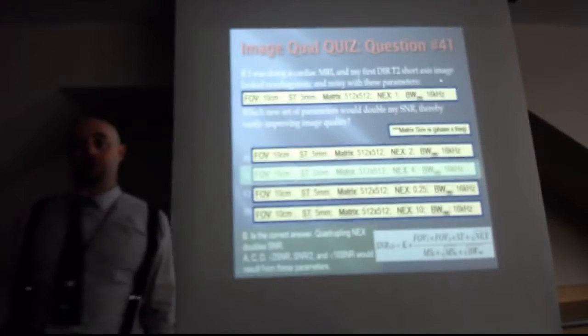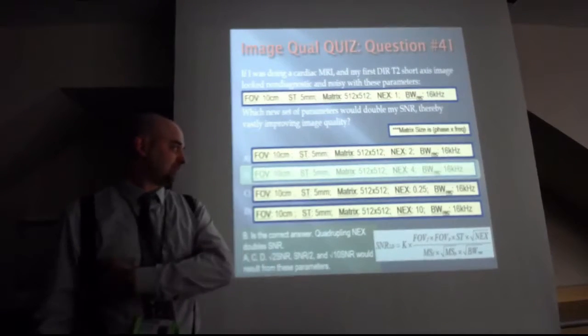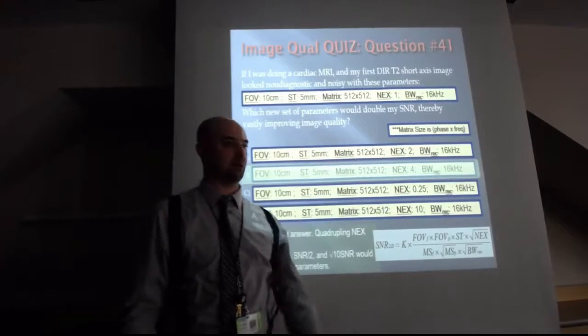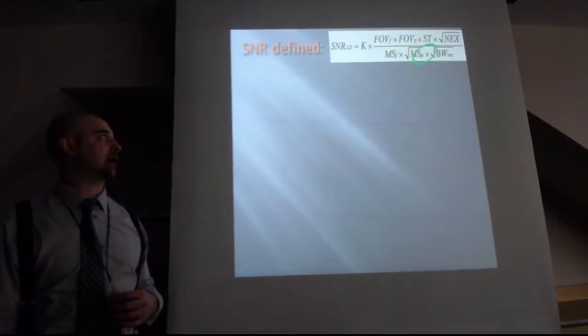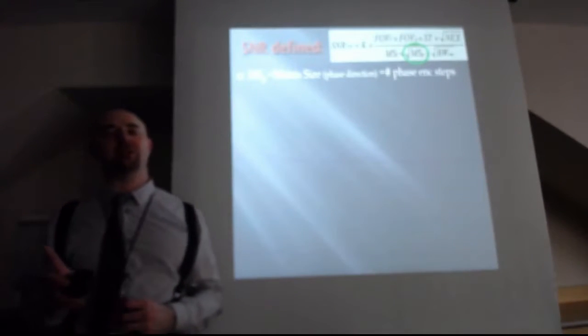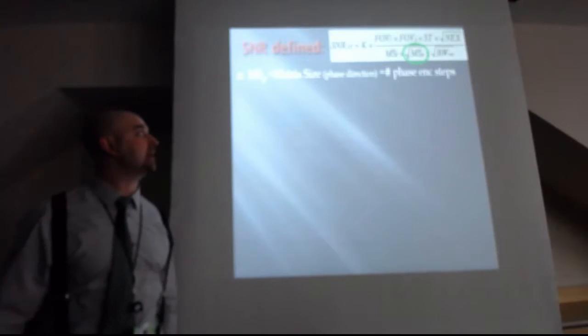So we just got done talking about NEX. No surprise. That was my target for the question. If you increase the NEX by 4 times, you're doubling your signal-to-noise ratio. Good. Okay. Now, let's move on to another one that's kind of a little hard to understand.